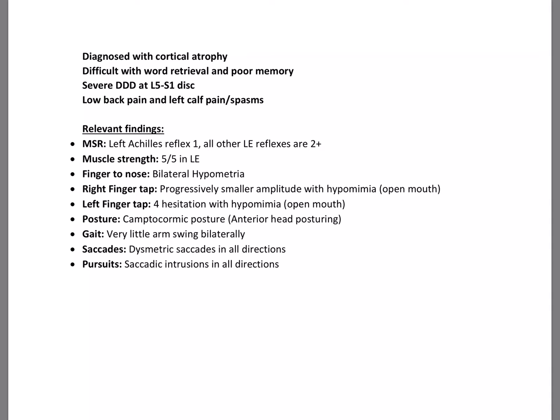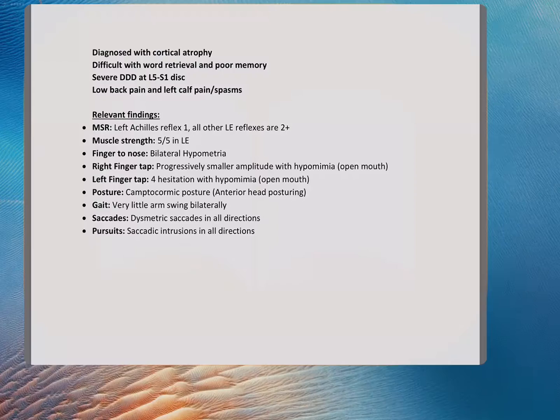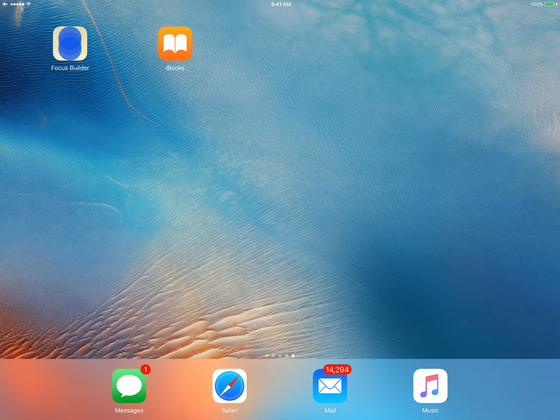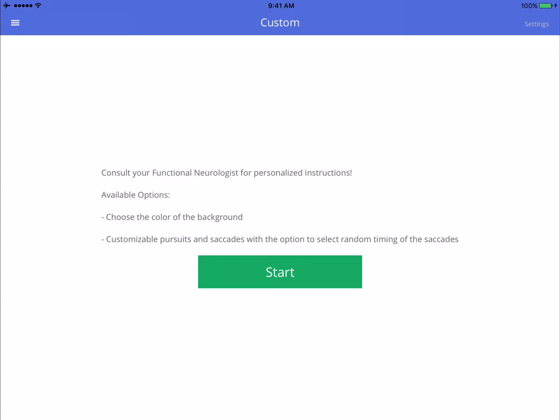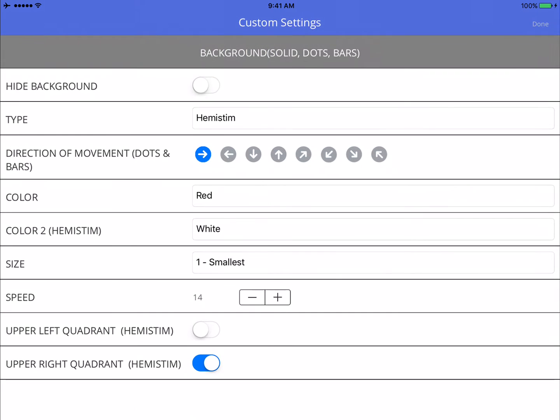So let's go to the FocusBuilder app here so I can show you what I did for this patient. I programmed one exercise in which, in the custom exercise here, in which I could try to achieve or target as many of the involved areas as possible in one exercise. So that would be left cerebellum, right cerebellum, bilateral frontal.